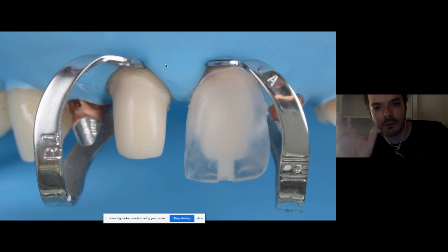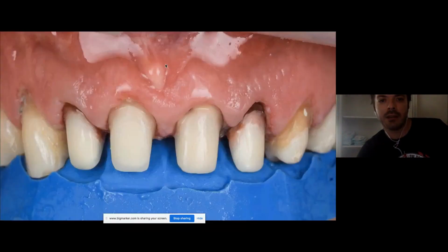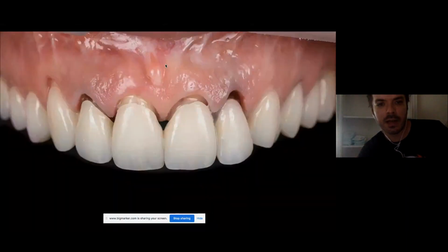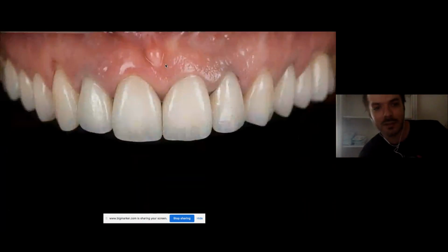You get a very beautiful, nice abutment that not only blocks your color, but will have uniform thickness, which is very important for the value and the uniformity of the restorations. So at this point, you can see I still have in the laterals the area where I didn't touch for the ferrule that I managed in a different way. I mean, the technician managed by staining inside. This area you can use an inside stain. Here in the picture is more than needed, again just for didactic reasons. You have to put just a little bit.